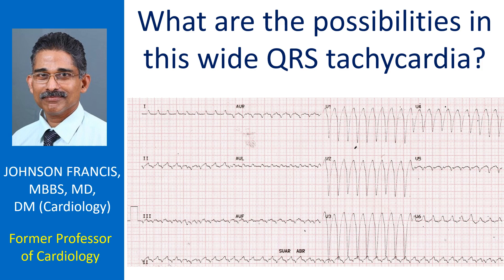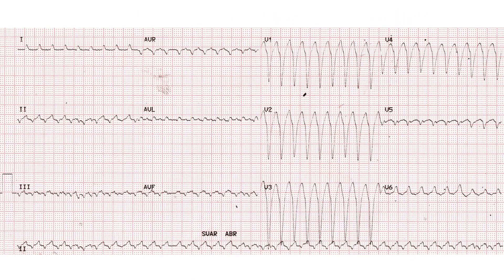What are the possibilities in this wide QRS tachycardia? Wide QRS tachycardia with a rate of around 225 per minute. Wide QRS tachycardia is to be taken as ventricular tachycardia until proved otherwise.